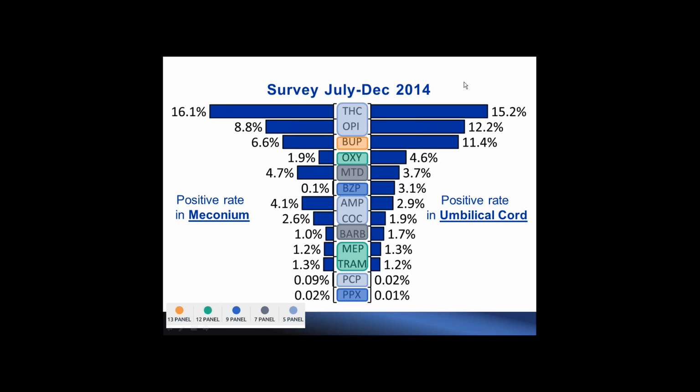So short. Thank you, Dr. Shu. I'm sorry, Kia, but the short answer is that we do see a higher positivity rate in fatty acid ethyl esters than in ETG in umbilical cord. Thank you, Kia.